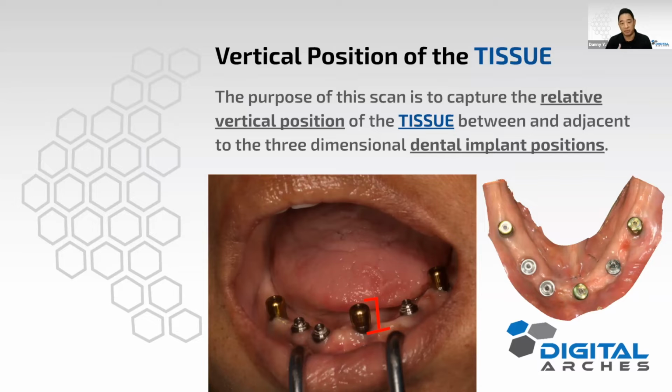And you don't necessarily want that, because when you contour a tissue, it's very bumpy, it's going up and down. That's going to create pockets of food particles and other things for bugs to grow in there. You just don't want that in a prosthesis. You want to keep the bottom of your prosthesis as flat or as convex as possible, so that it is as hygienic as possible.